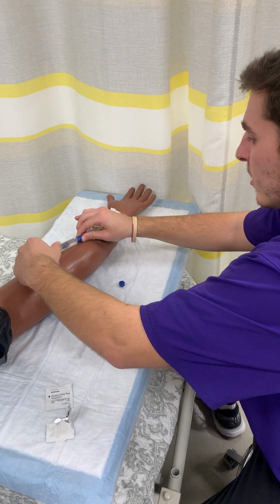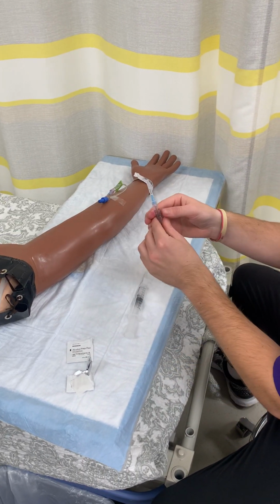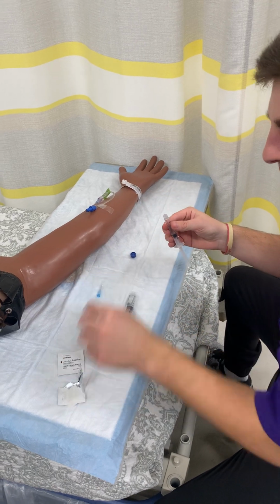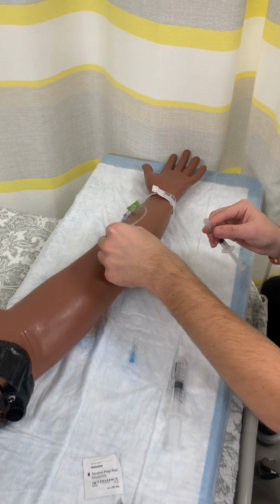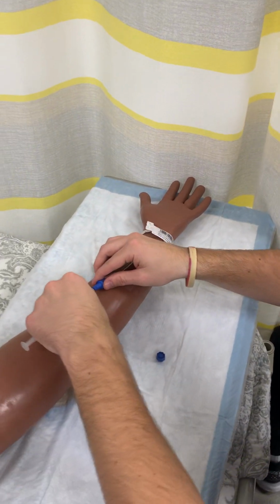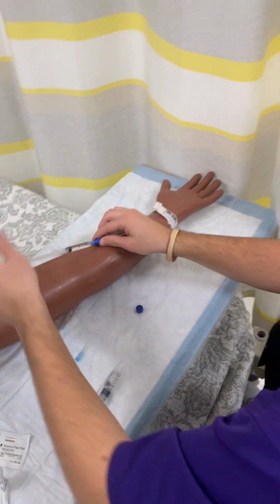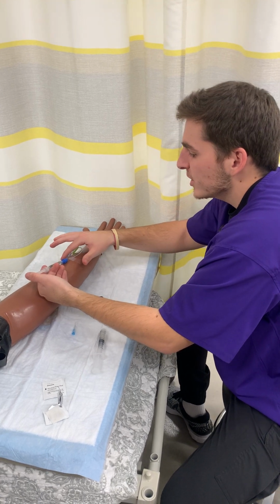Now I'll take this off. I'm going to grab your dexamethasone here. I'm just going to scrub the top of this, as well as this. Now when I give this, I'm going to be giving it at about 1 ml a minute, and while I'm doing this, I'm checking the vein for any infiltration.